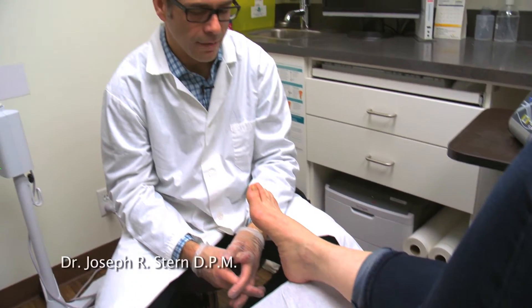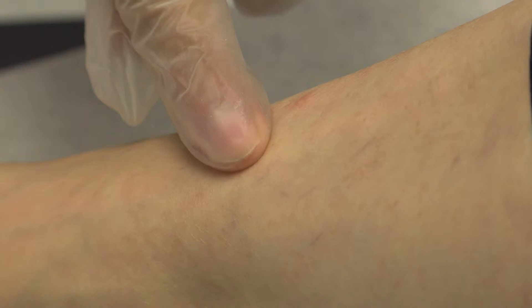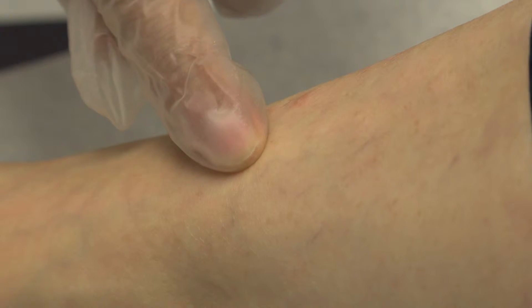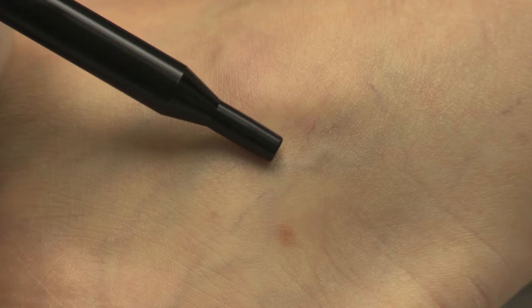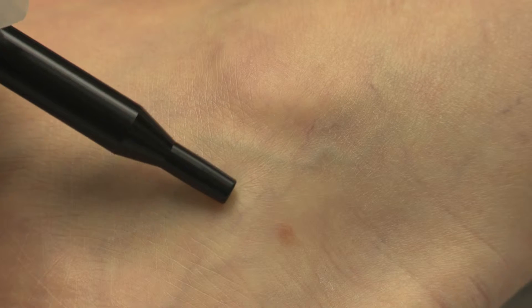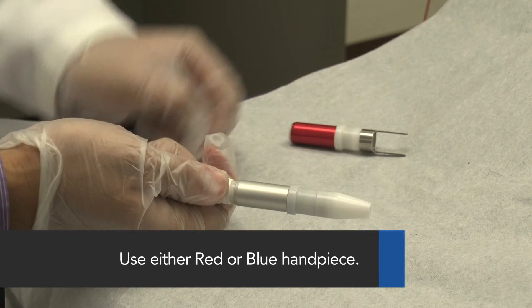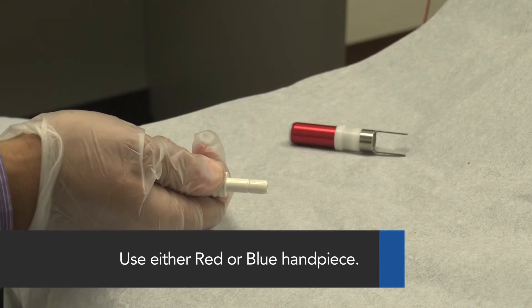It is important to conduct a simple pre-treatment examination on all patients. Visually identify the target blood vessels to be treated. Assess the patient's skin type and select the appropriate handpiece.